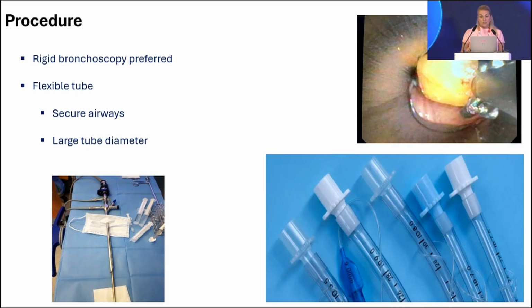Which procedure is preferred? We prefer the rigid bronchoscopy because we have a secured airway the whole time, and with the rigid I have more space, so I can remove bigger foreign bodies. But we can intubate the patient also with a flexible tube and secure the airways.